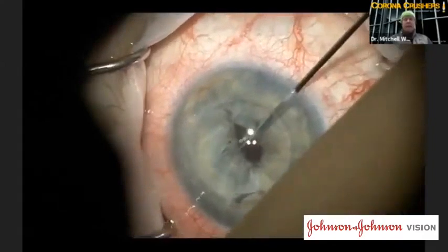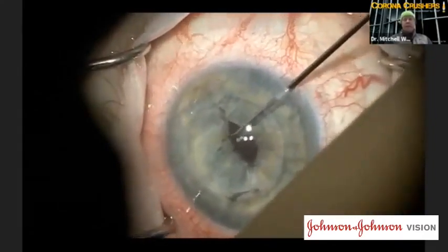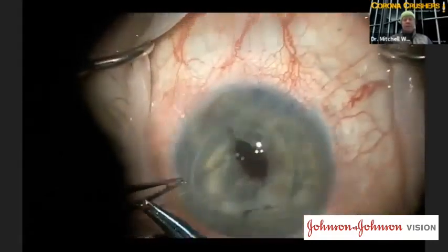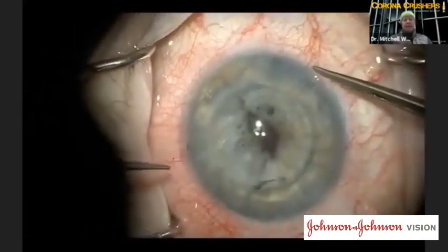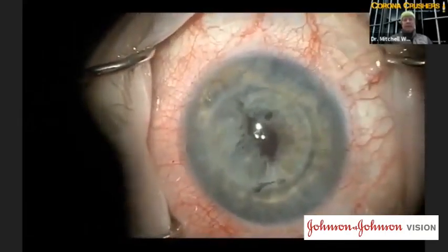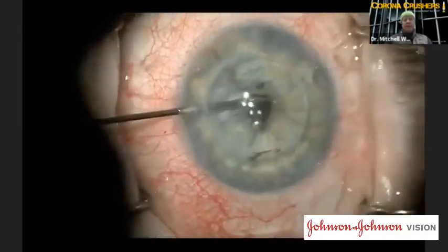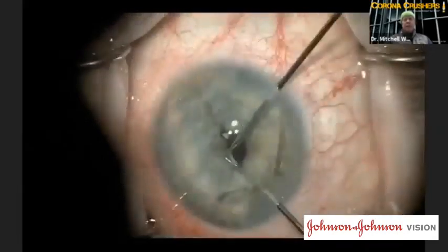Now I've got an ovalized pupil here, so I'm going to sculpt it. So here's one way you could do it. I can make little sphincterotomies here on each side. And once I do that, I think, well, let me pass one more suture to center things even a little bit better. So again, you can take your time and alter your technique to get that pupil as perfectly centered as possible. I'm going to do more sphincterotomies here.